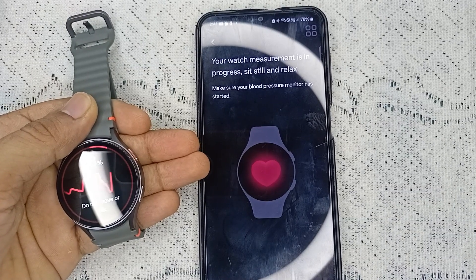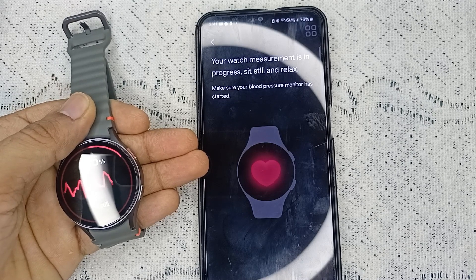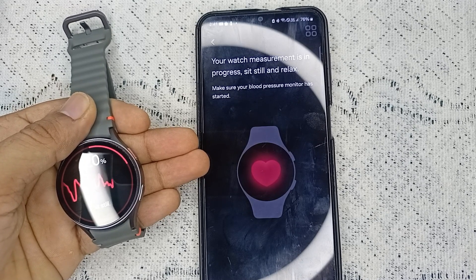The measurement will now start. It will take some time — around 20 to 30 seconds — to complete the process.